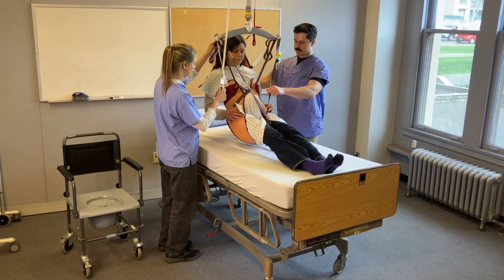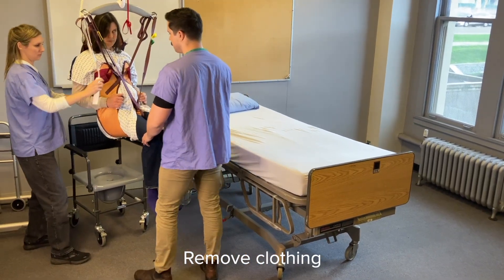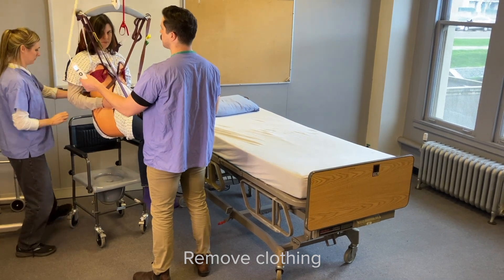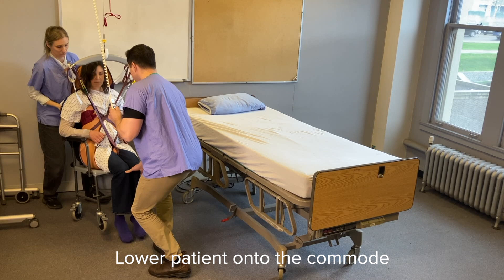Transfer your patient onto the commode or toilet. Check with your patient and remove clothing necessary for toileting. Lower the patient onto the commode or toilet.